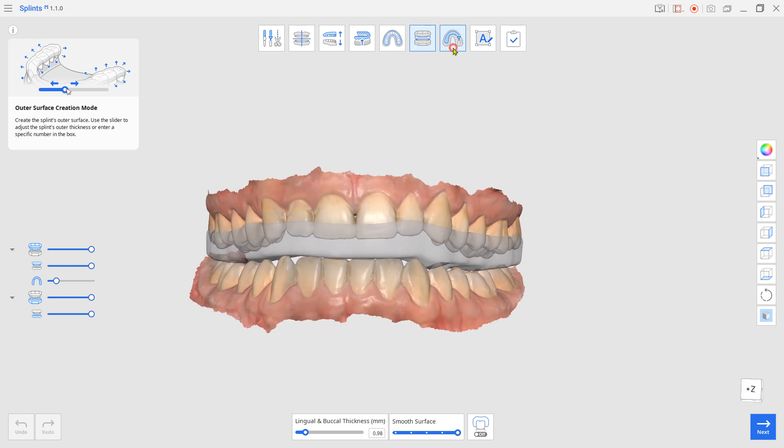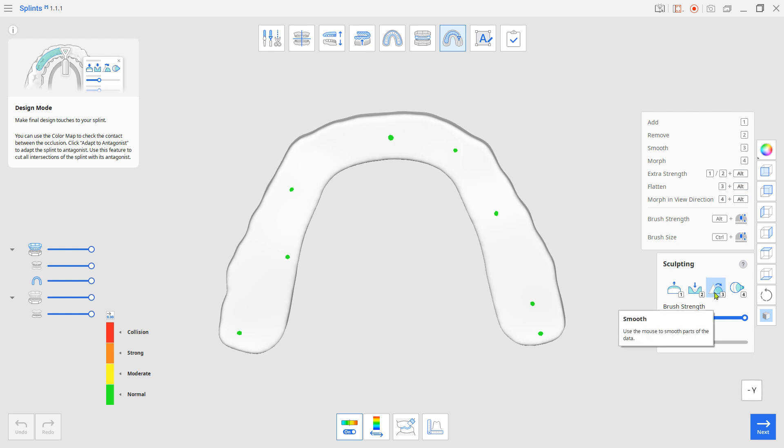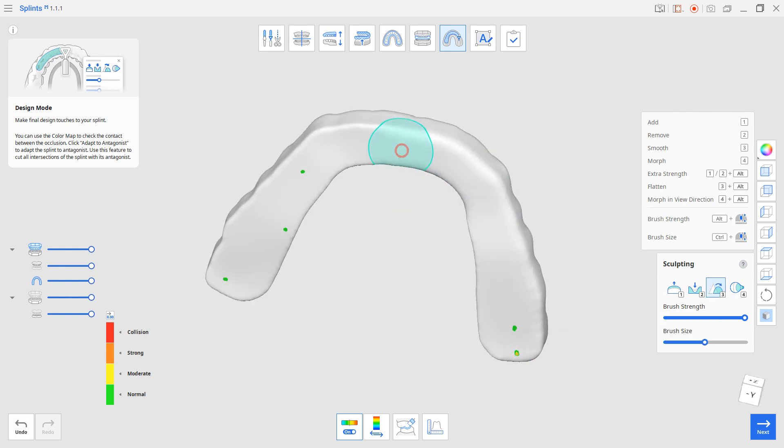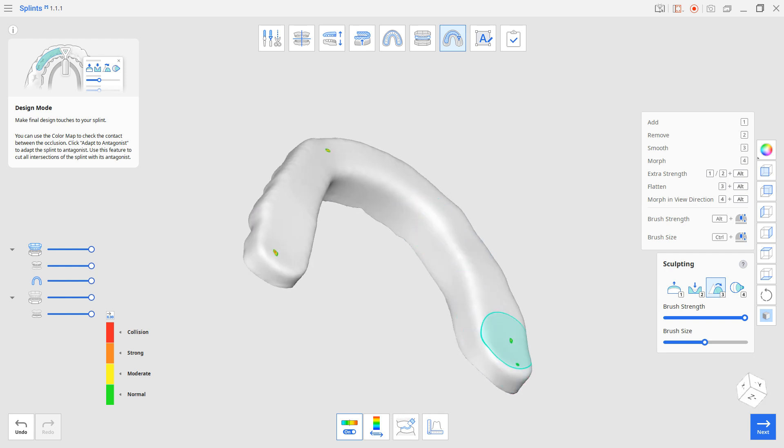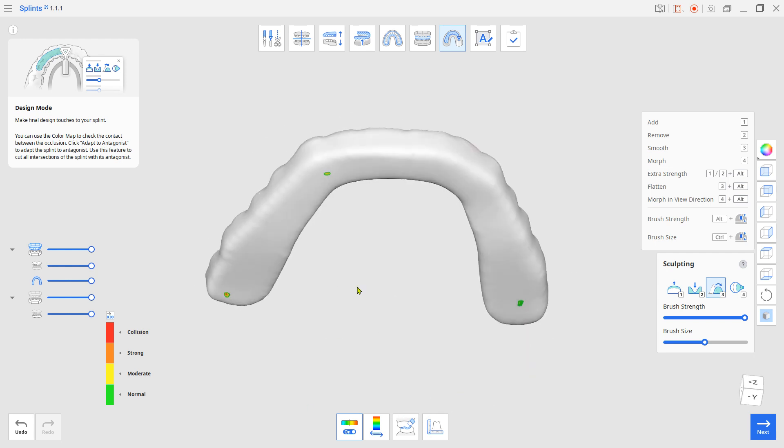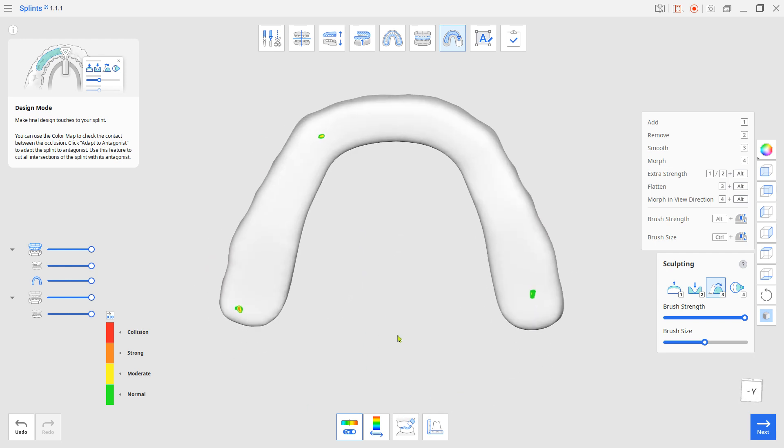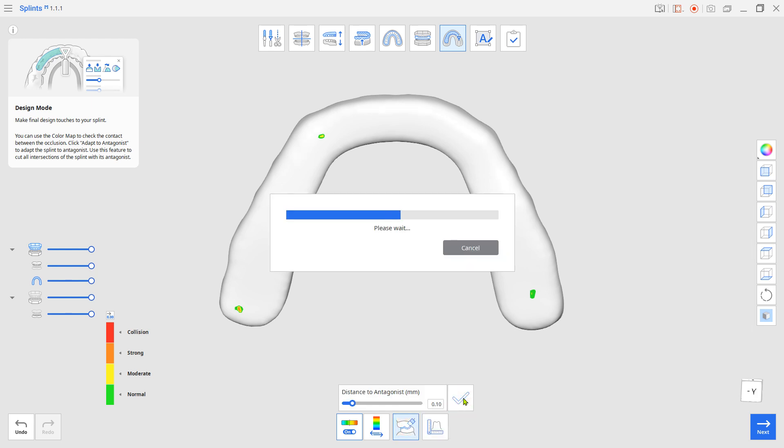In design mode, if you are willing to smooth out the angled edges, use the Sculpting Smooth tool to do so. And use Adapt to Antagonist to remove any occlusal contact spot.